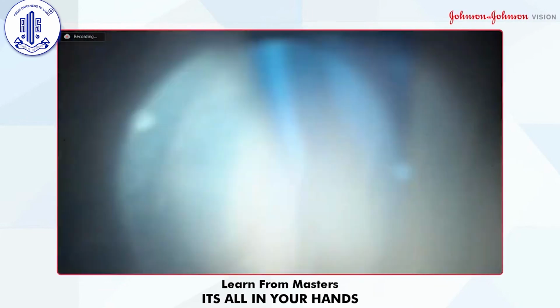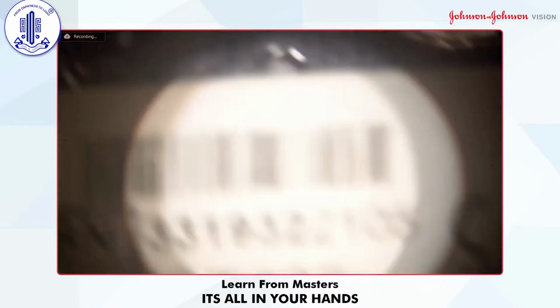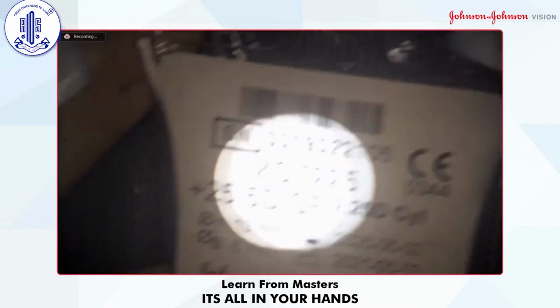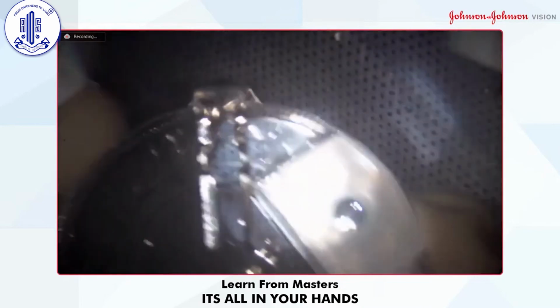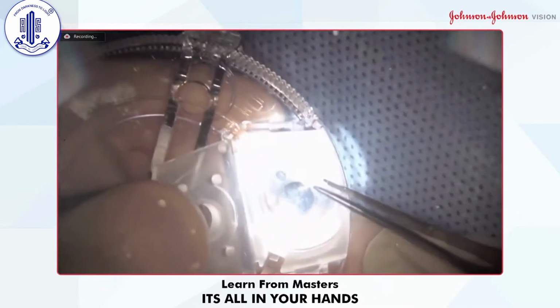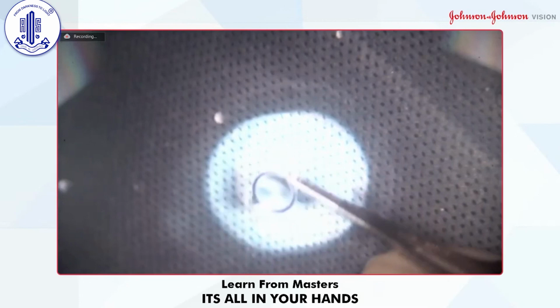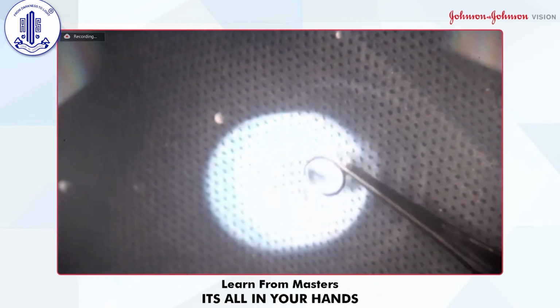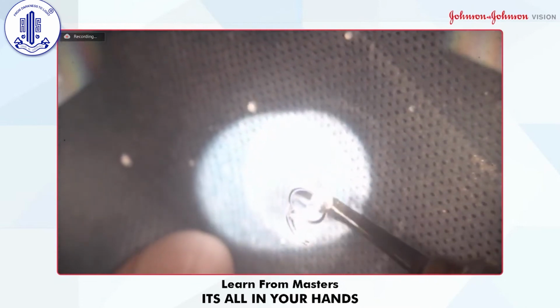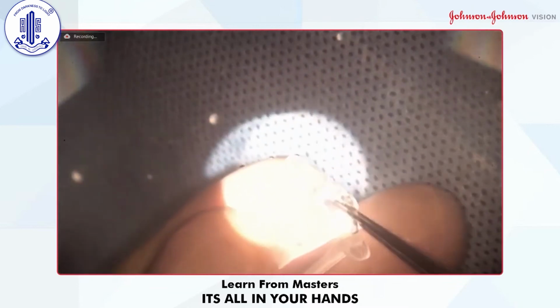So again you can see this is ZCT225, 25 diopter, and this time I'll put a little bit, a drop of viscoelastic over the lens so that it does not get stuck. So chances of entanglement, you can say, the stacking of loops are less.